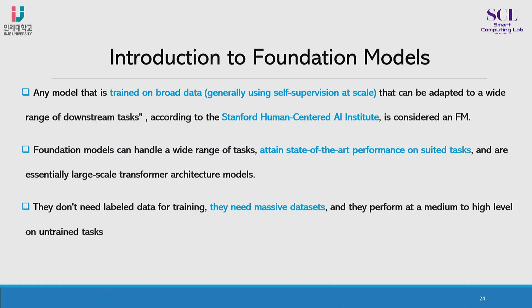So to develop this foundation model, we need a massive amount of data. It is not possible with a limited amount of data. People are using millions of data for developing foundation models. And in digital pathology, this is very trendy nowadays. Even at Stanford, at Harvard, and some big research centers, they are using this foundation model.